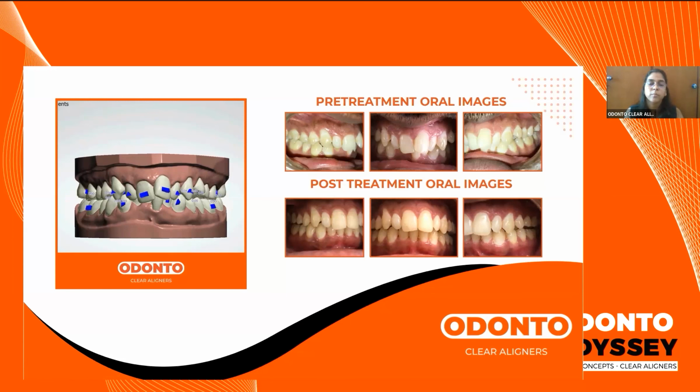You can proceed with that to have a more aesthetic result in terms of your anterior. In cases of crowding, what we would have required is proximal reduction, but we avoid that to a certain extent because the tooth size is already small. It's not too bad aesthetically, which is why we can leave them as they are and not try to change the shape of it.